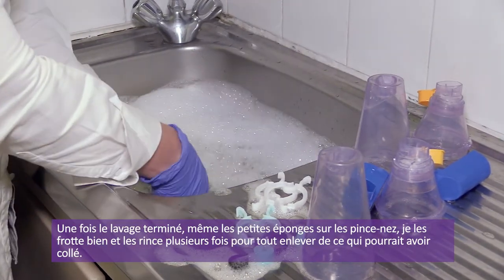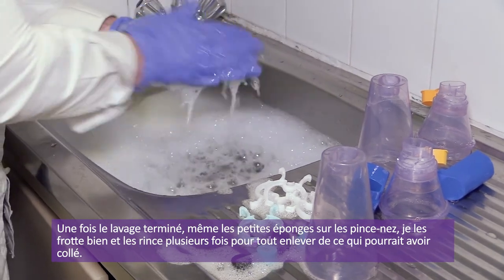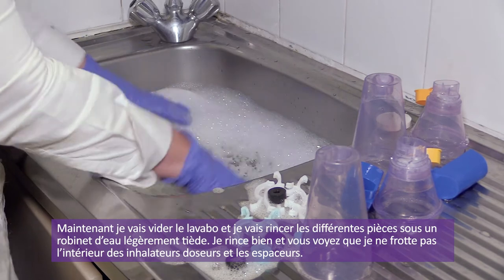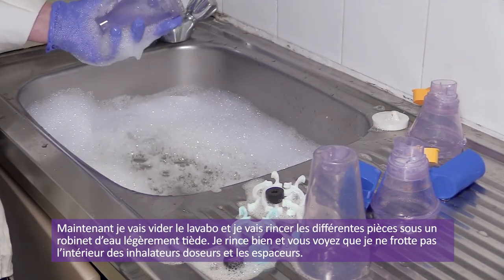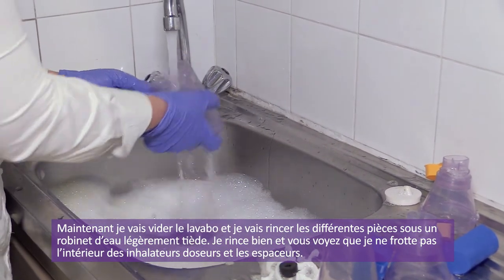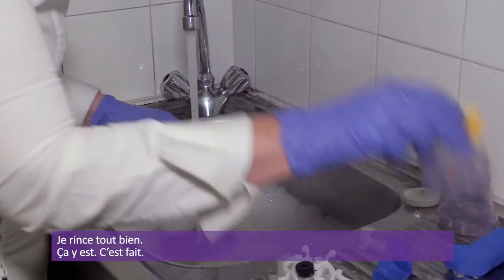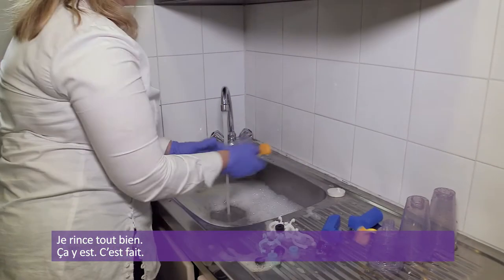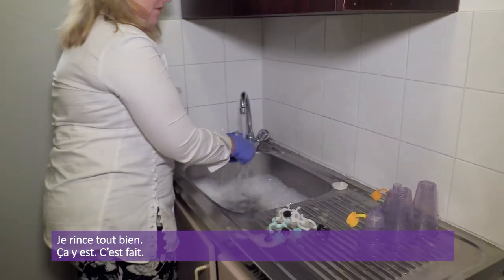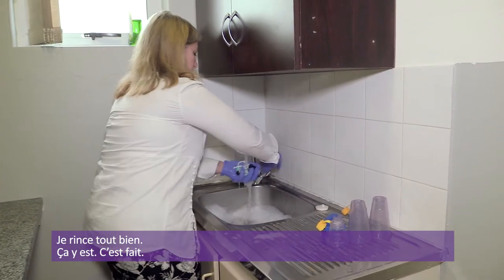I wash each piece individually using nothing abrasive — just soft gloves. Wherever the mouth has touched, I make sure to clean the proteins off thoroughly and agitate everything in the warm soapy water. The sponges of the nose clips I'm particularly rubbing clean. Nose clips are disposable; if you want to reuse them, wash them thoroughly. Now I let the water out and rinse the devices under tepid water, not rubbing the inside of the spacer devices.